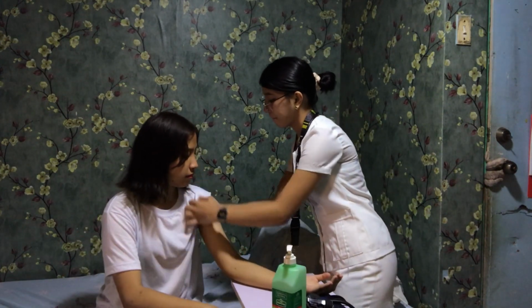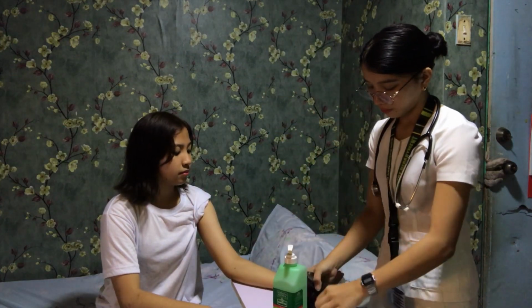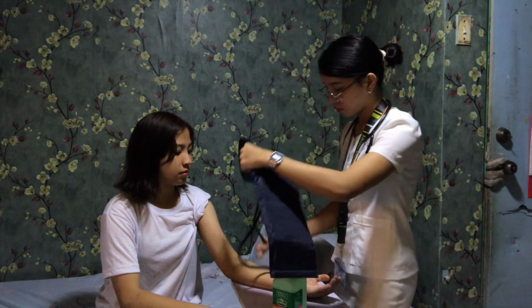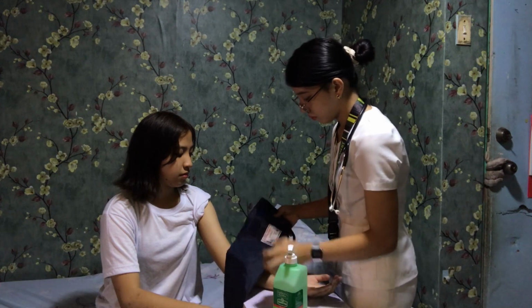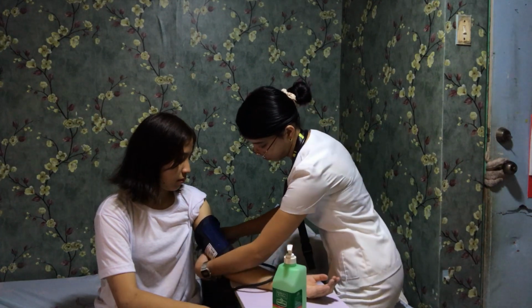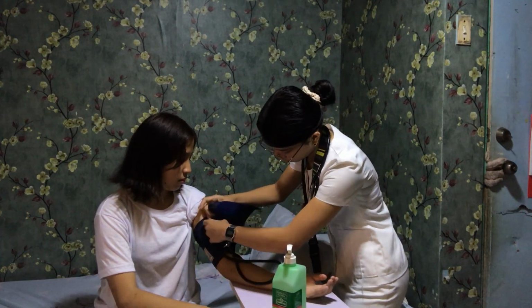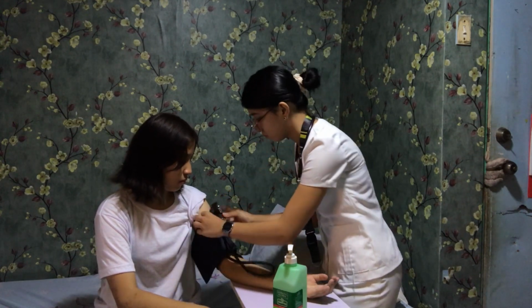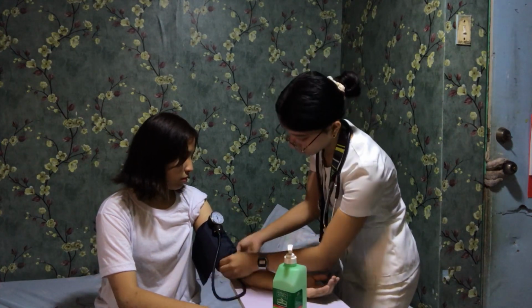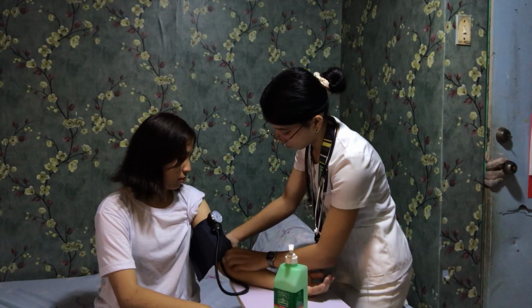Alright, since the cuff is already fixed, now I need to locate her brachial artery using my 2 fingers.